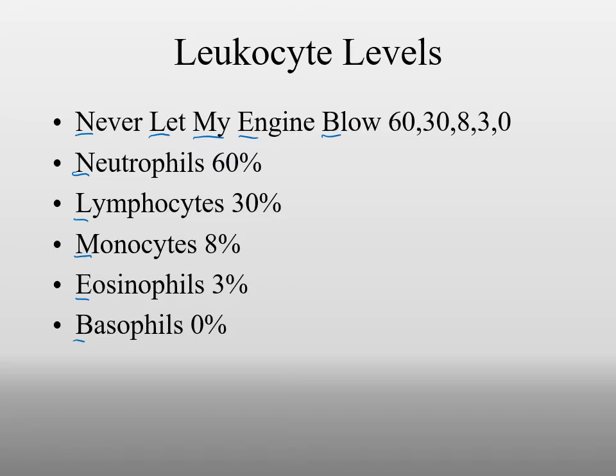How many of the individual cells do they have, which can give us an idea of what potentially is trying to attack the person, and what kind of an infection they are potentially fighting off based upon the white blood cells that they have elevated within the body itself.